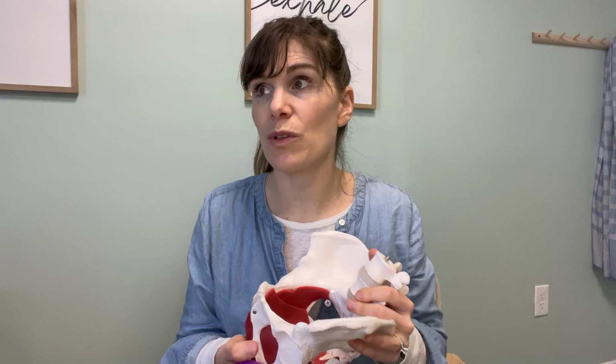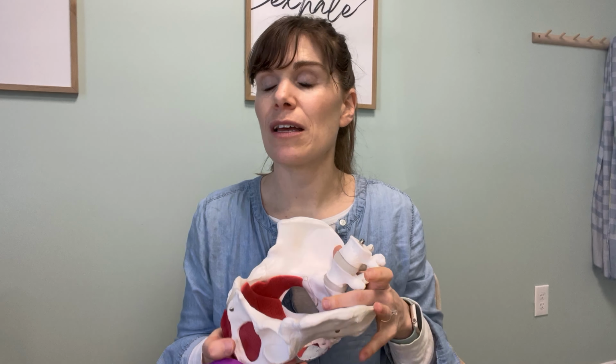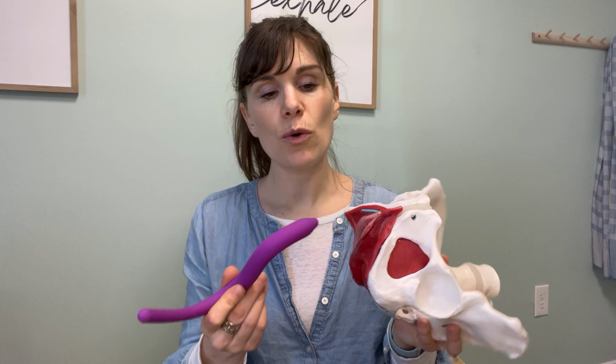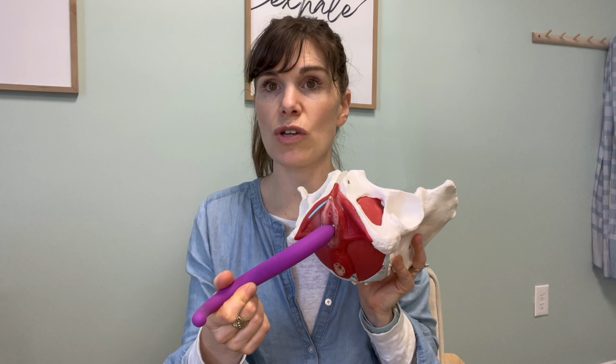So the first thing that you want to do is get into a really comfortable position. You can be in your bed, built up with a whole bunch of pillows so you're nice and relaxed. It could be after a warm bath. You could be standing in the shower too, if that's the only place that you can get some free time. But make sure that you are in a place that you feel comfortable and safe. Have your wand washed and lubricated, and you are going to bring it to the opening to start with.